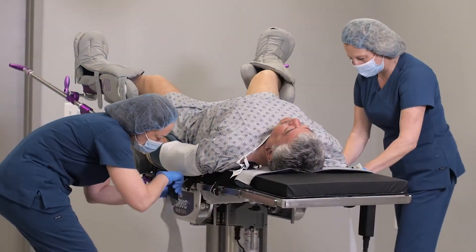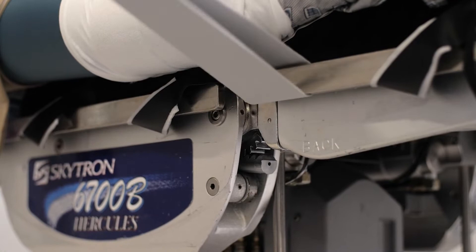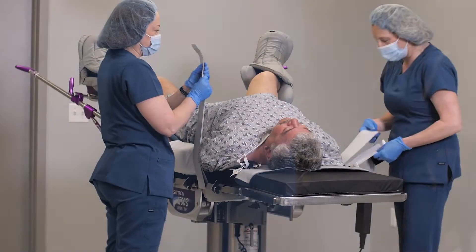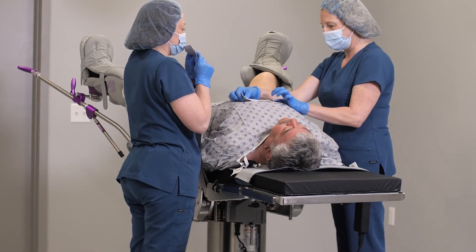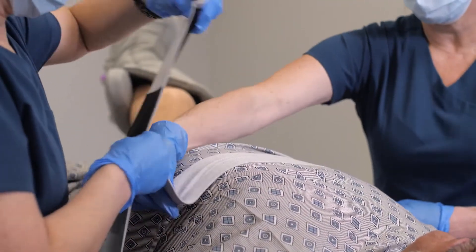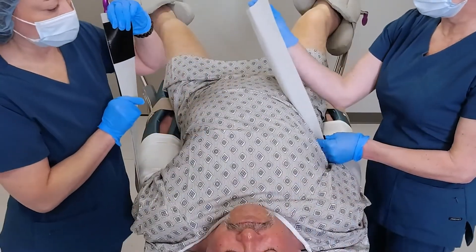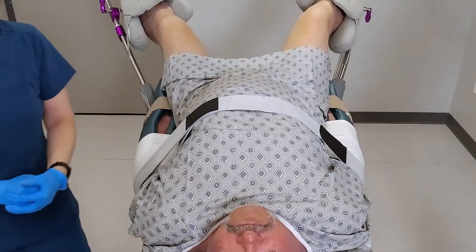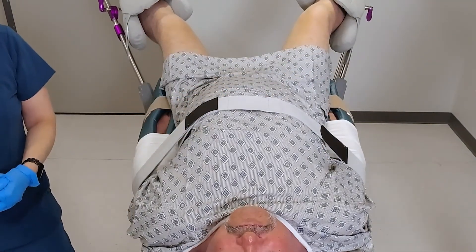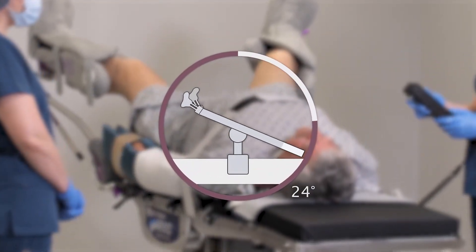To connect the patient safety straps, thread one strap through the closed rail post section on each side of the OR table. Make sure to follow the labeling on the straps. Attach the velcro to the strap itself, making sure the foam side of the strap is against the patient, then adjust the straps accordingly. Bring the patient safety straps across the patient's chest and attach them to each other to secure the patient to the OR table and Hovermat T-Berg. Once the patient is secured, position the table in Trendelenburg for the procedure.